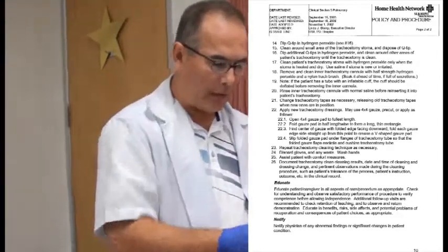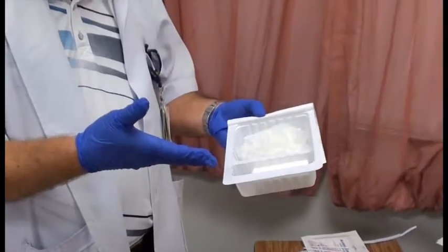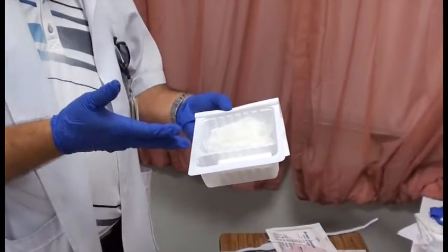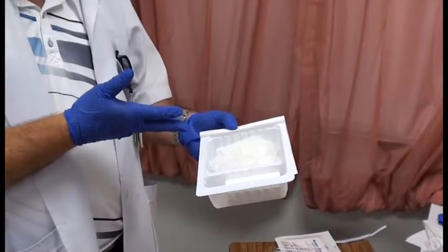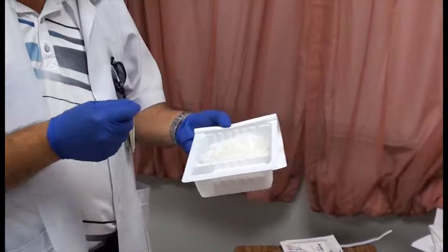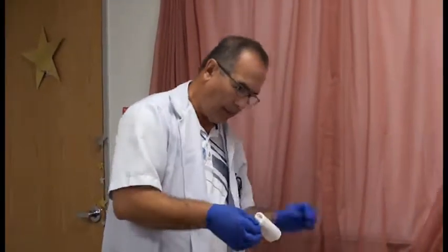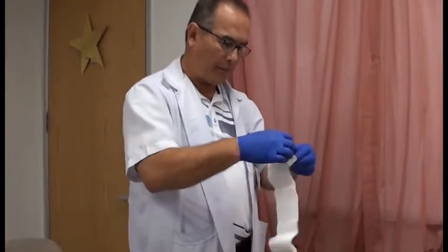And as you can see, there's two compartments. One has the smaller compartment with the sterile drape, and then the other side will have the sterile gloves and the rest of the cleaning kit. So we're going to take our drape here and create a sterile field for us to use.